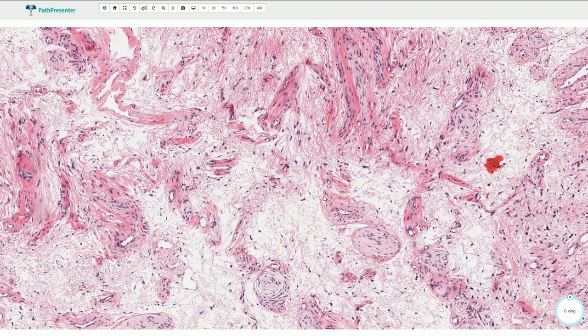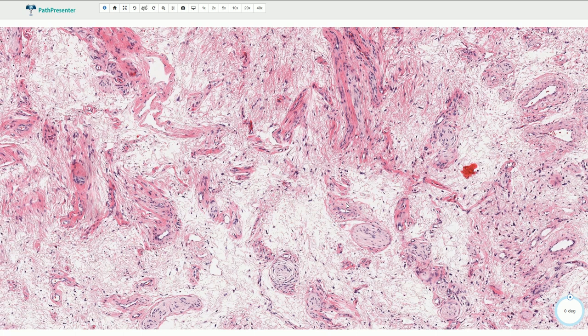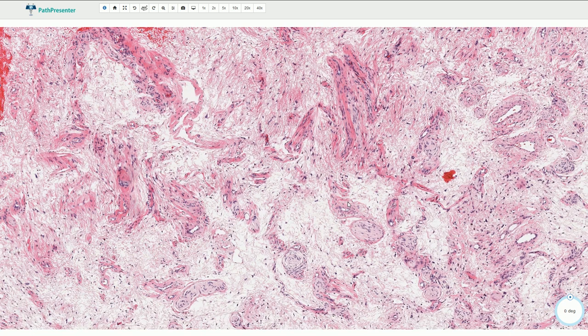An important differential diagnosis includes superficial angiomyxoma, which is superficial and does not involve the deeper structures. Angiomyofibroblastoma is also quite superficial. It is usually well circumscribed and it contains zones of alternating cellularity, so we see hypocellular areas but also some hypercellular areas.